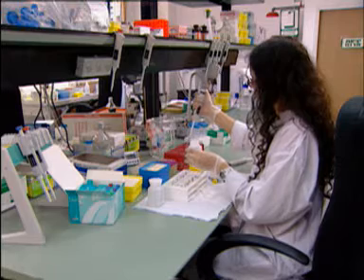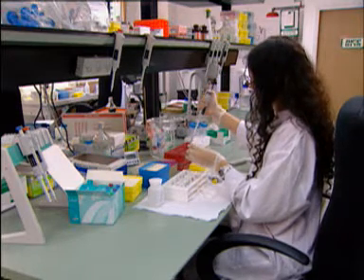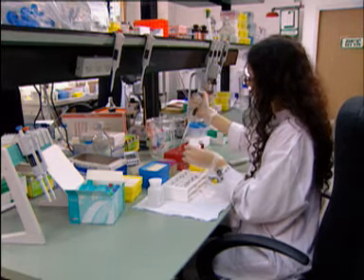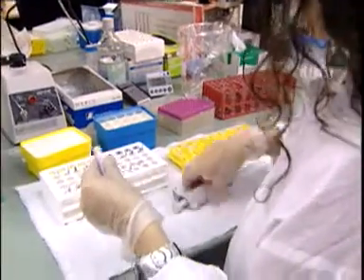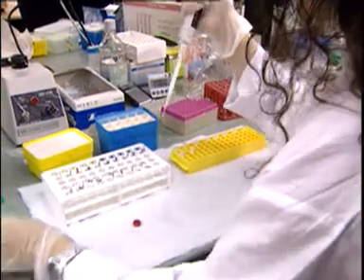This third kit detects the level of autoantibodies to thyroid's antigen in sera samples. To the first 6 tubes, differing levels of thyroglobulin autoantibodies are added, and this set of 6 tubes is used to draw a calibration curve. Positive and negative control serum are added to the next 2 tubes, followed by the test samples.